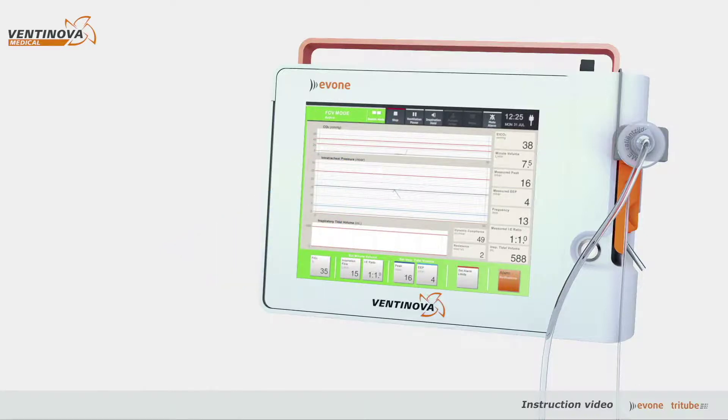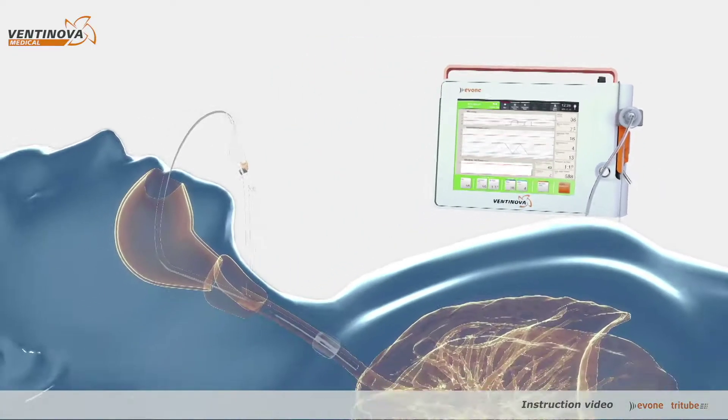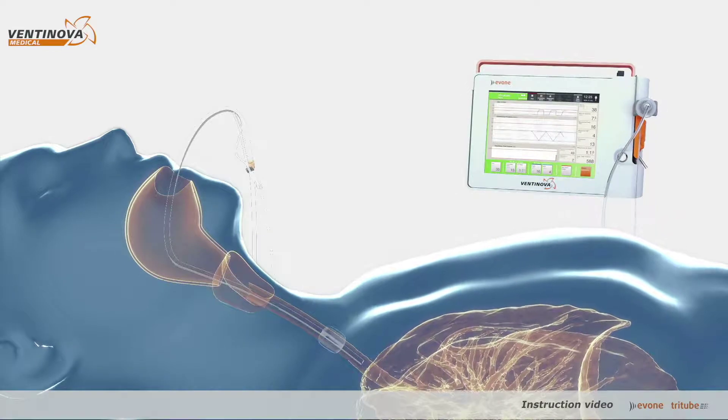Graphs displayed show end tidal CO2, intratracheal pressure, and inspiratory volume. Please note the typical pressure curves with linear increases and decreases in intratracheal pressures.